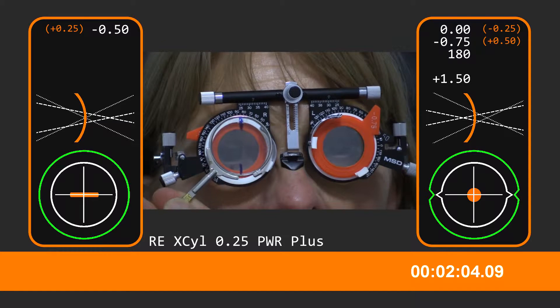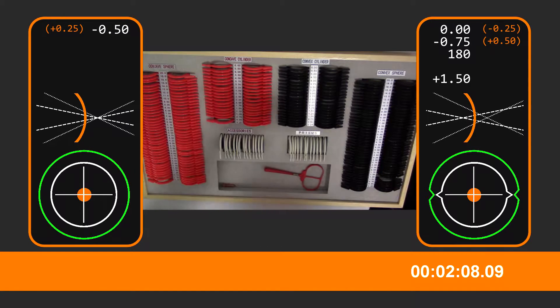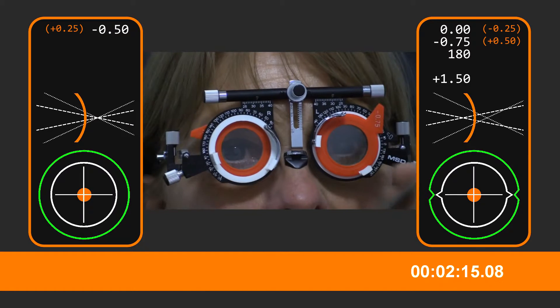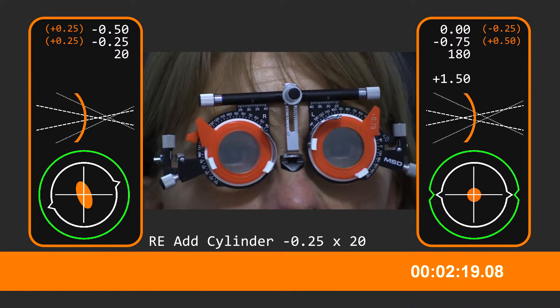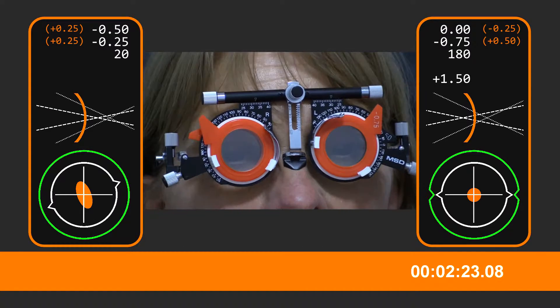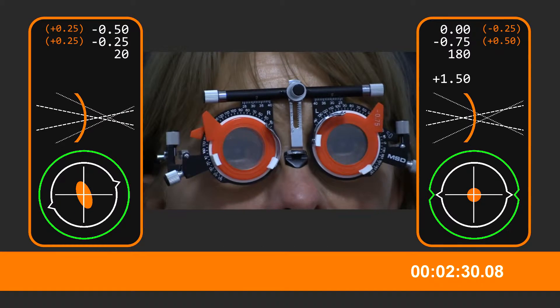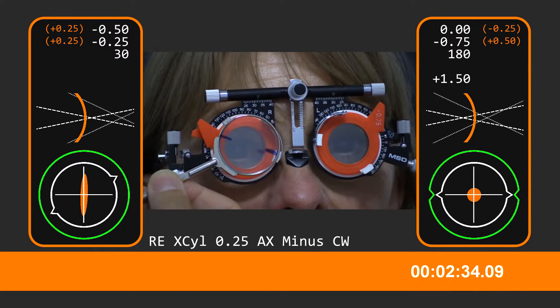And have a look at these spots here. Now which side of this lens is clearer — the first side or the second? Second side. And again, first one or second? And what about these two — first one or second one? First. And these two — first one or second? Second. Second one.